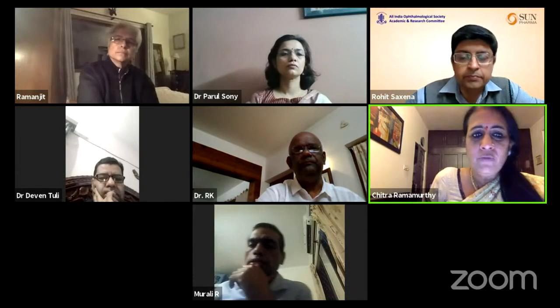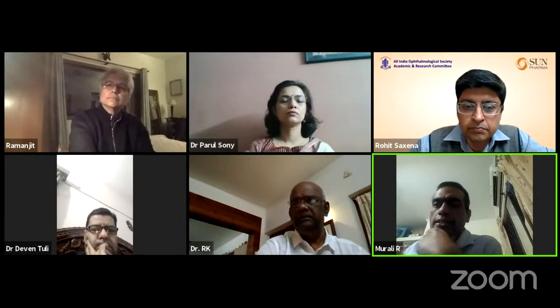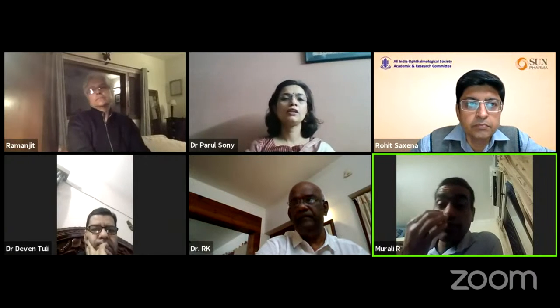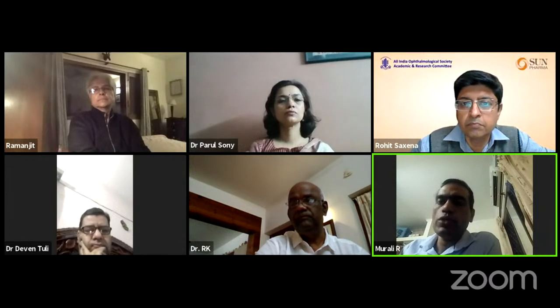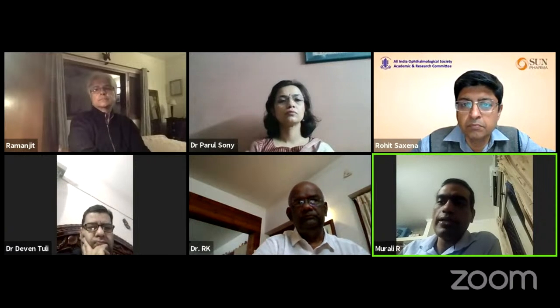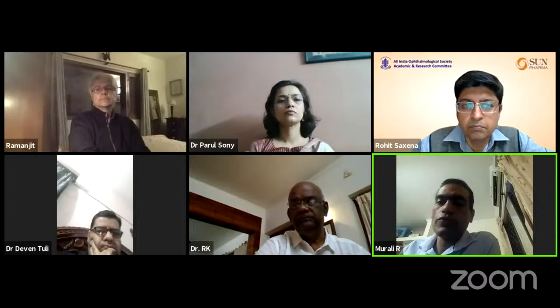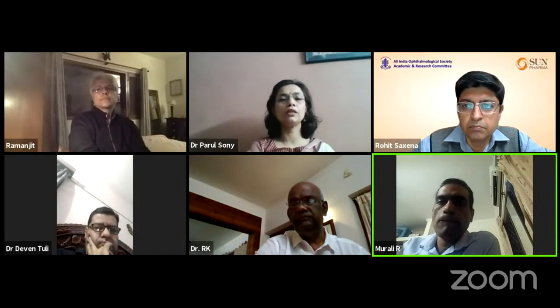Murli, do you have any other question to ask before we move on to this very important topic? I have a question for Dr. Parul. In moderate and severe glaucoma, how frequently would you be repeating the fields? I mean, like once every 3 months or once every 2 months? And the glaucoma progression analysis doesn't give you a progression for the macular and 10-2 fields. So how would you assess progression on macular and 10-2 fields? Okay.